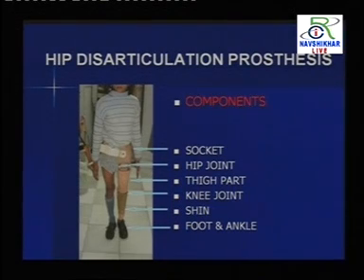And for making the patient walk, you have to use the rotation of the pelvic girdle. Even the hip is not there. With pelvic rotation, then you have to take a forward move. So that is the problem, and she has to learn how to walk. You have to train the patient to walk without any support for a longer period.